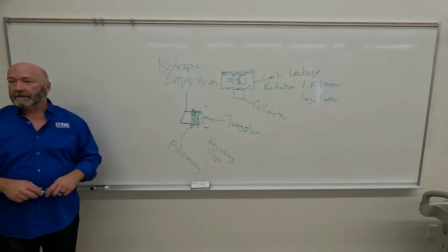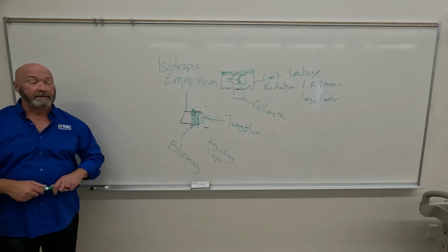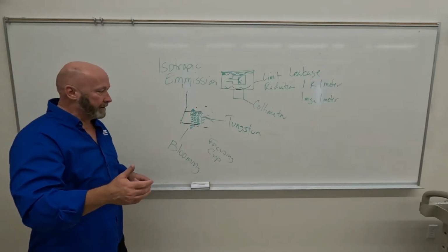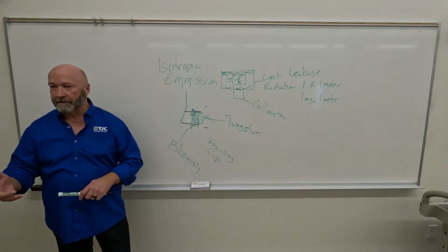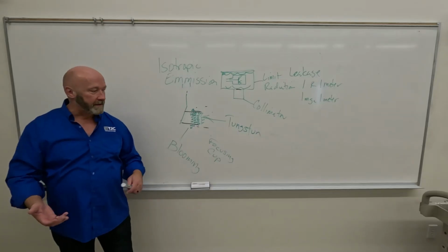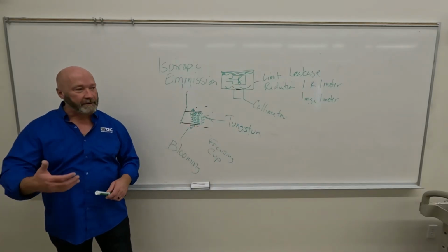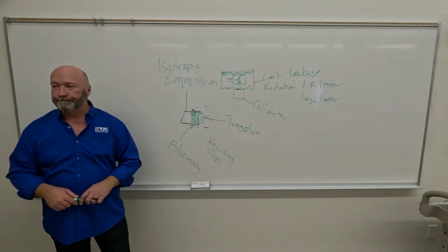So you do the math, 7,000 degrees Fahrenheit is a lot, right? So very, very high melting point. That's one thing, but it's also a good conductor. We want that. We don't want a lousy conductor because we have to have a space charge. We have to have a lot of electrons. We have to have that flow of electrons. So it's got to be a good conductor.